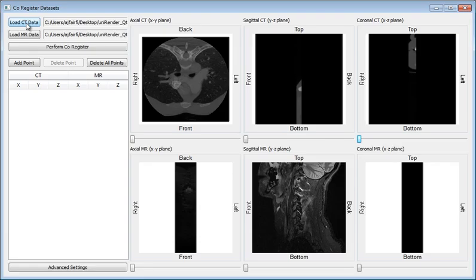First, the technician loads both datasets. Once loaded, they can then browse the image slices from any planar view.